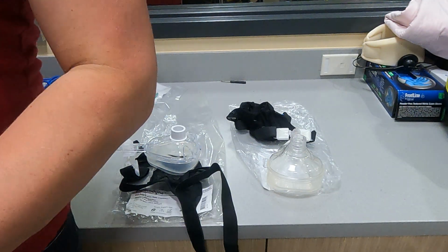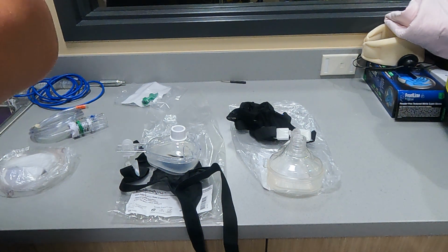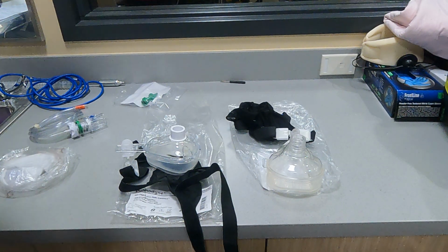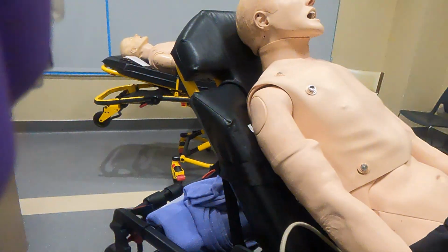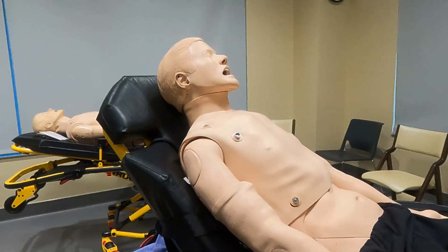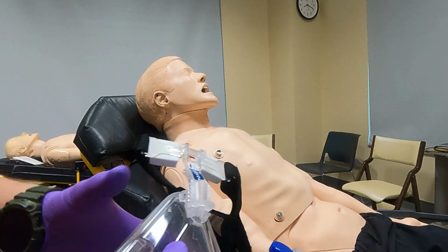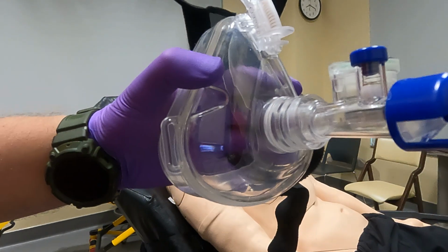So I'll get that hooked up to my oxygen source, which I'm not actually going to turn on because otherwise it'll wash out all the sound of the video. So let's turn the camera here so we can see our patient. There he is. Now, we're going to take our mask, and this just clicks right in there, just like so.